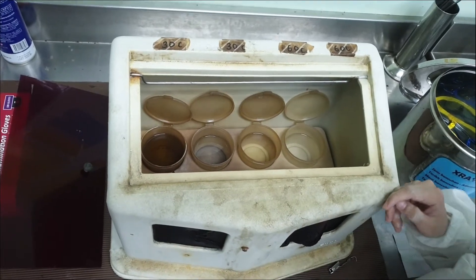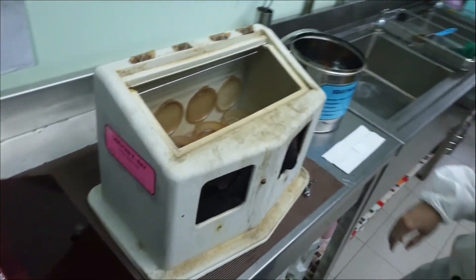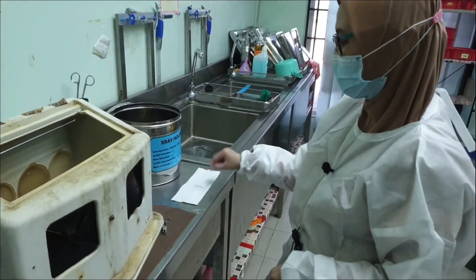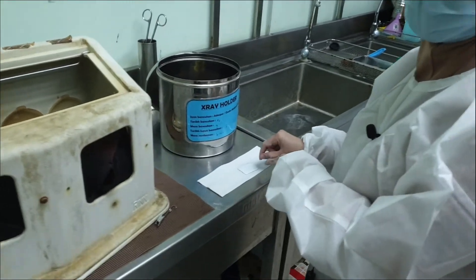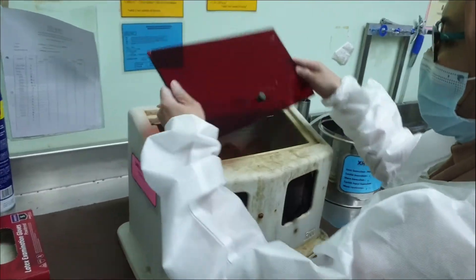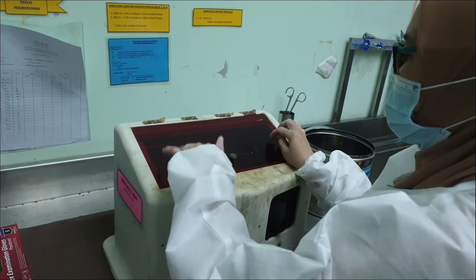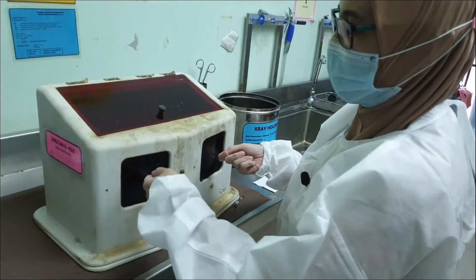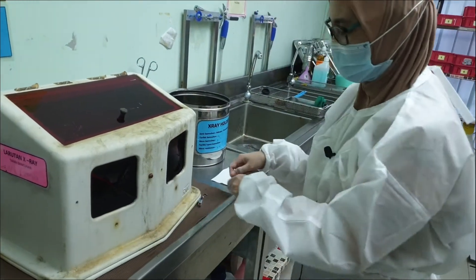What you have to do is use the clipper and clip your x-ray film. You need to close this box first, and of course you have to wear your gloves. Place both hands together with the x-ray film inside the box.